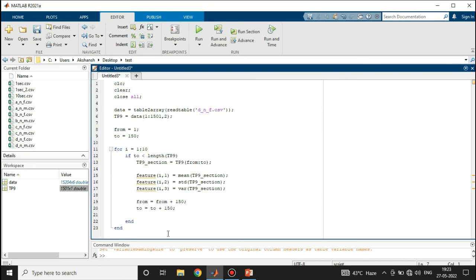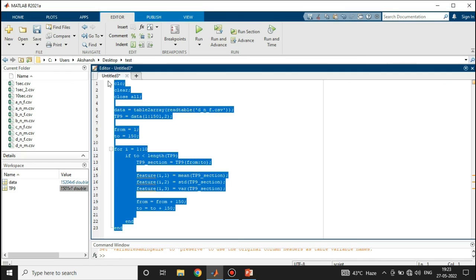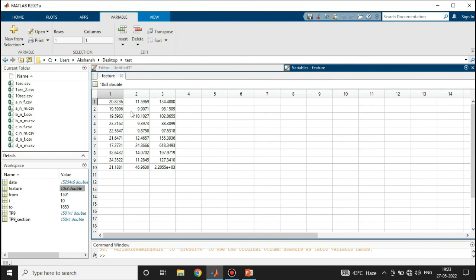Let's run the program. These are the features extracted from the 1500 samples of TP9. The first row shows the mean, standard deviation, and variance of the first 150 samples. The second row shows the mean, standard deviation, and variance of the next 150 samples, and so on. I hope it made sense.